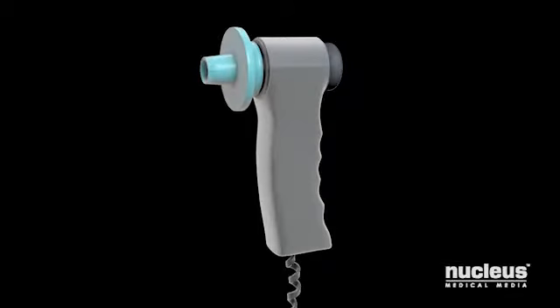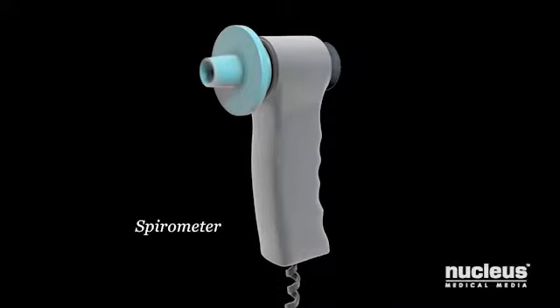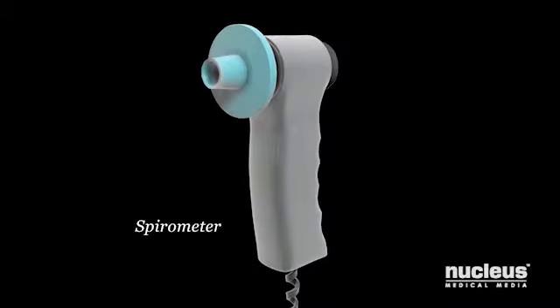During the test, your caregiver will use a device called a spirometer. A spirometer is a machine that measures exhaled air.